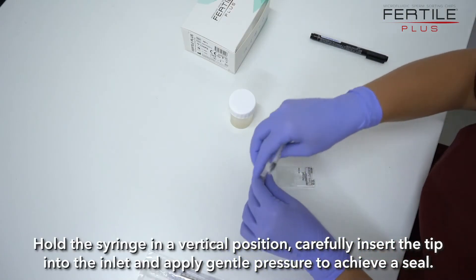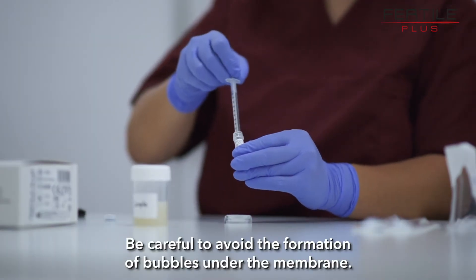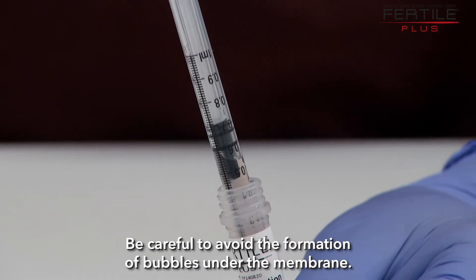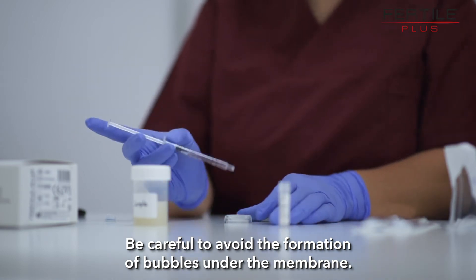Prepare a fresh syringe with 750 µL of Sperm Wash solution. Cover the entire upper collection chamber, ensuring an uninterrupted flow of media over the membrane and the outlet port.